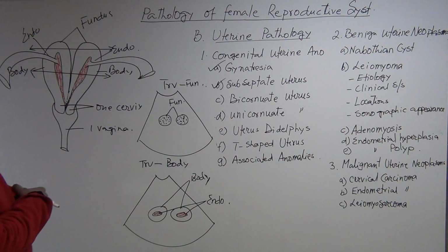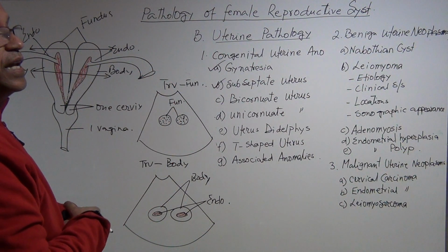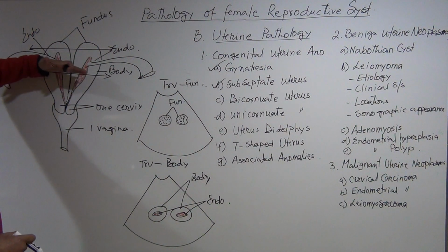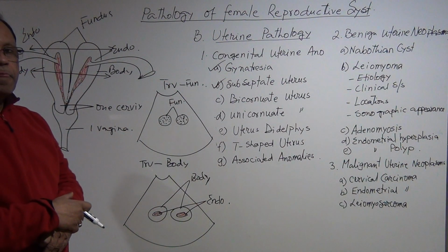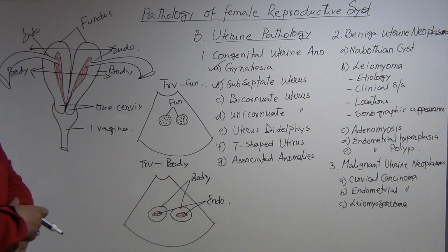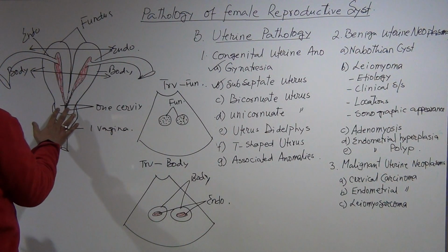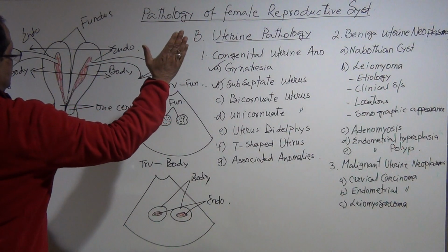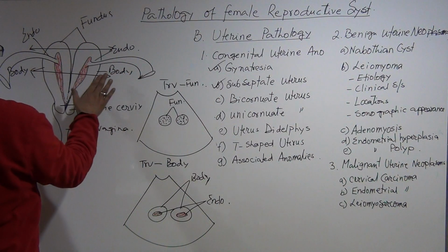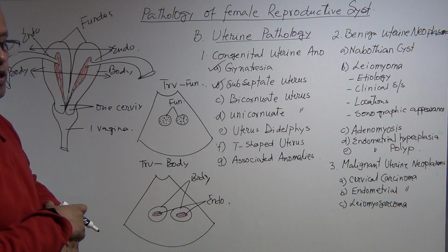So you can see sonographically very nicely two separated bodies with the endometrium. And now your transducer is at that level. Then you go down, down, and you will see only one cervix. Then go more down, you will see one vagina. But from this level you go up, then from the cervix there will be separation of the endometrium. Body are two, endometrium two, fundus are two, the two domes in transverse view.